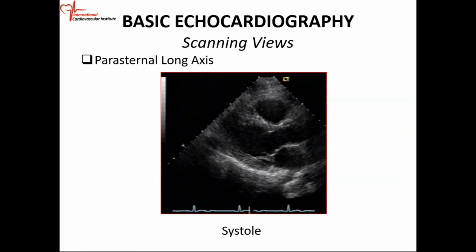All right. So again, in systole, the aortic valve is open, the mitral valve is closed. In systole, we're going to do certain measurements. I put this measurement in systole, but this measurement should actually be in diastole.